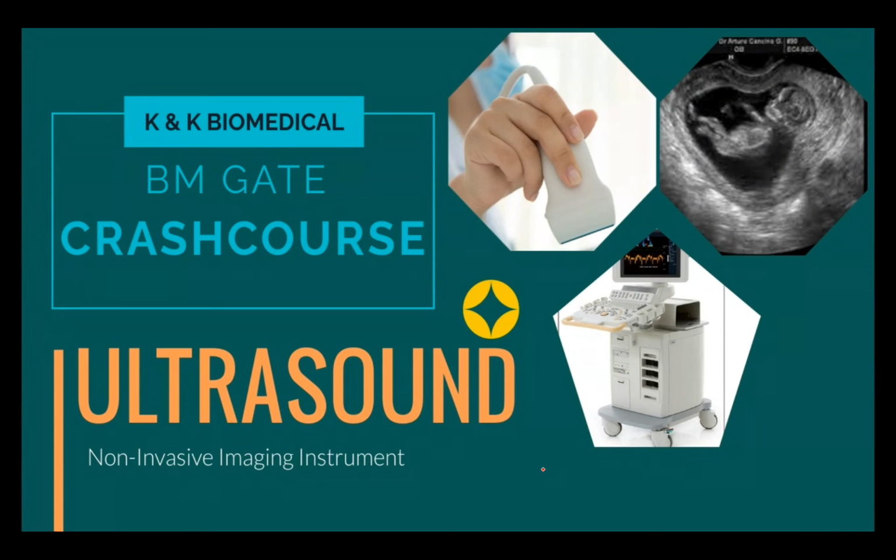If you consider that scenario, ultrasound has a very unique feature because we pass a sound wave. So there is no radiation here. With the help of sound, we acquire images. That's why we prefer ultrasound for imaging the fetus, the babies inside the womb. If it were invasive, we could not do that, right?